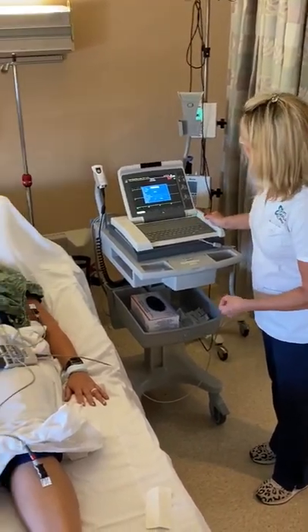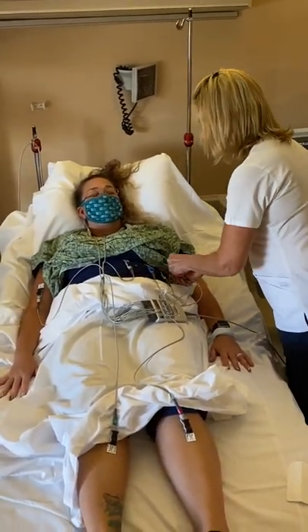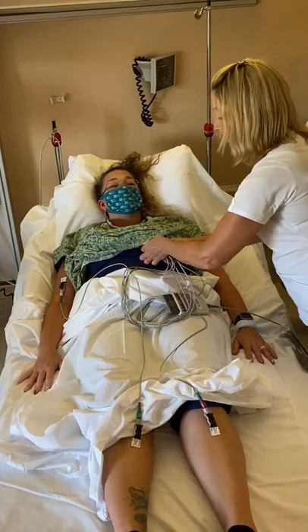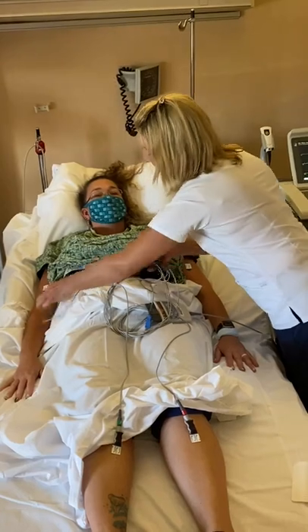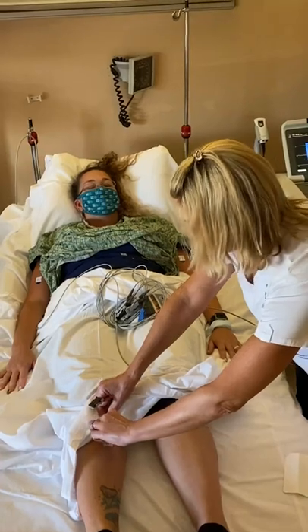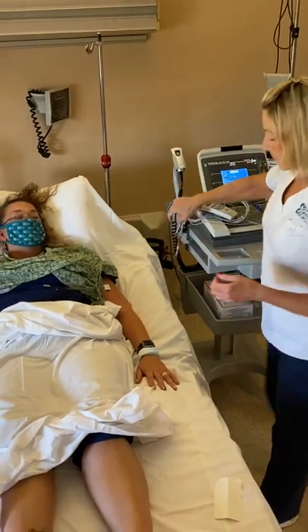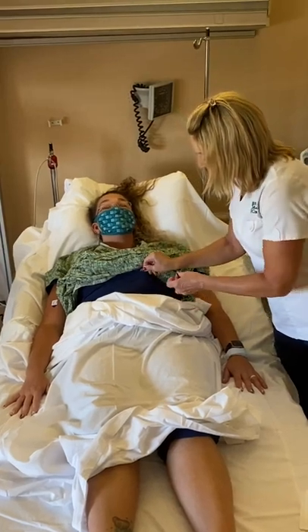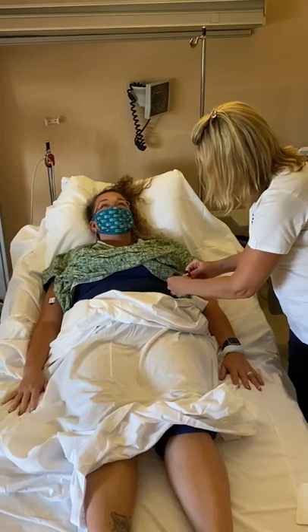Mrs. Little, your EKG looks wonderful, I'm happy to say. Okay. I'm going to take these leads off. So you take the leads off first. You should never tug and pull the leads and the stickers off together, especially on our older population folks. You will take all of their skin with you. So once you have all the leads disconnected, you'll take all of the stickers off. Do not leave the stickers on the human. They become like glue. So you take all the stickers off.